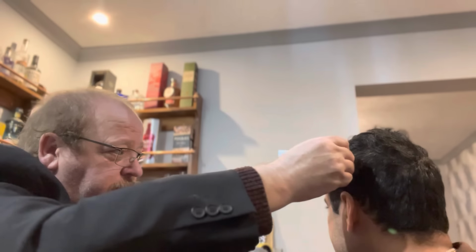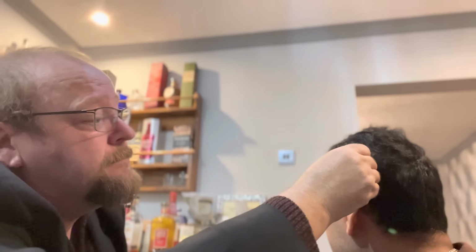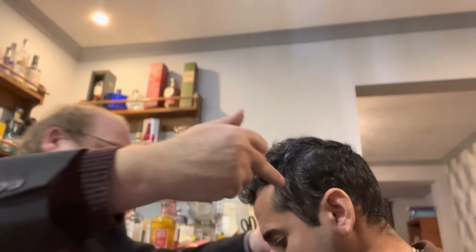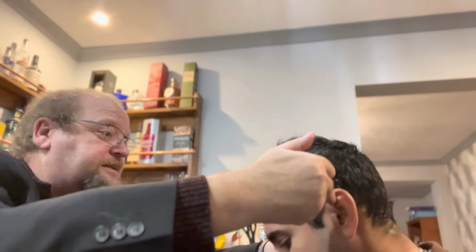So I need to measure the other side now. So again, I'm projecting from the crest. That's 120, so that's actually 135. So if you tip your head forward, what I'm going to do now is just check with my fingers, and yeah, I can see that there's quite a big difference between the two, but again, it's quite normal.